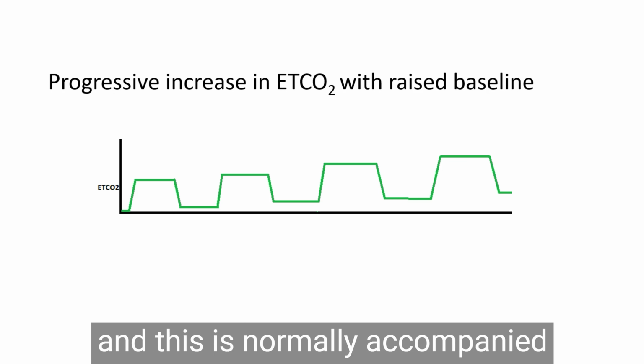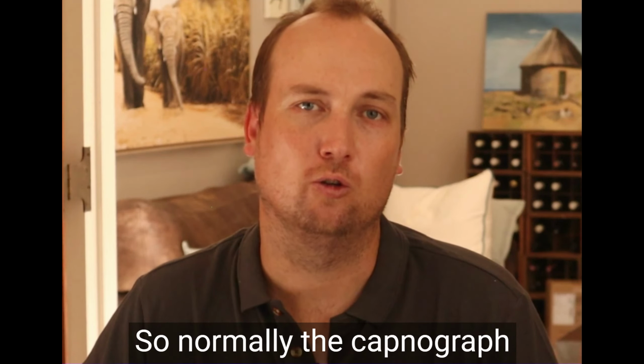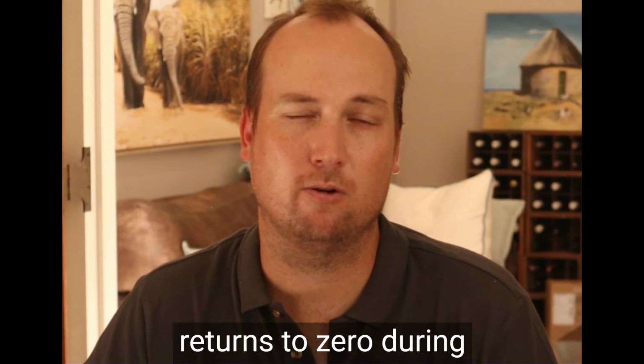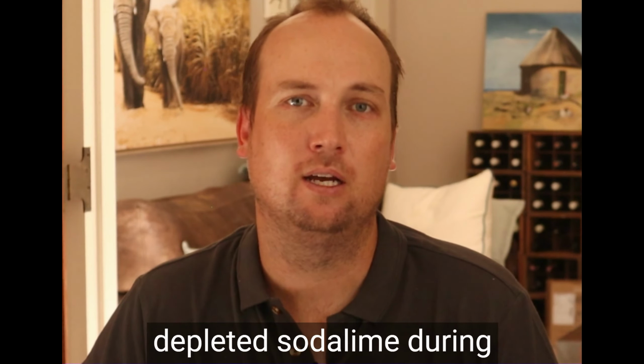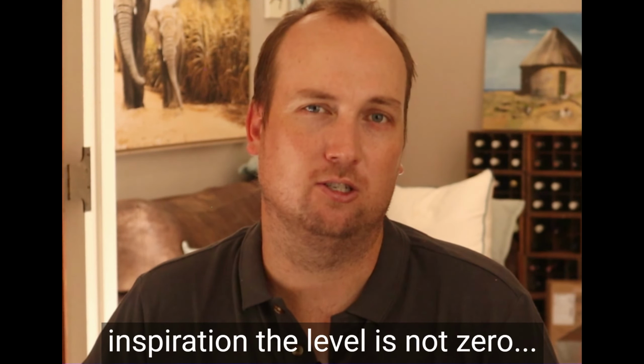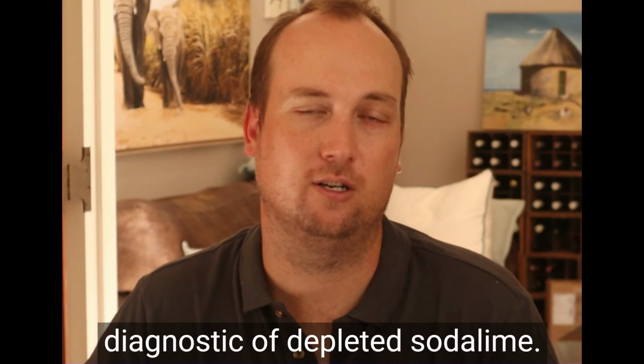And this is normally accompanied, though, by a baseline on the capnograph that is above the 0 level. So normally the capnograph returns to 0 during inspiration, and if there is depleted soda lime during inspiration, the level is not 0, it's 5 or 10, and that is diagnostic of depleted soda lime.